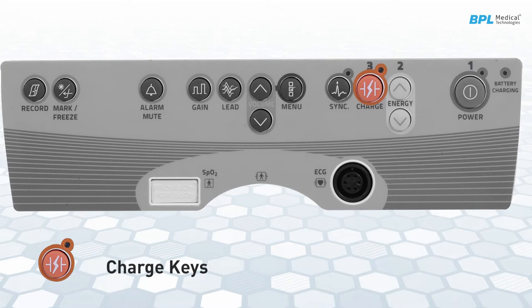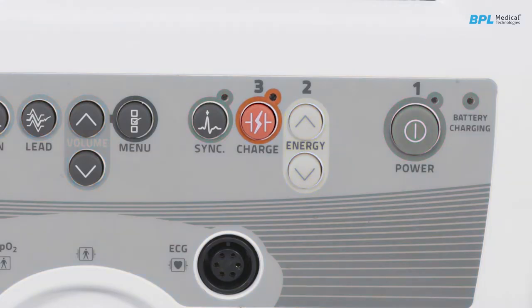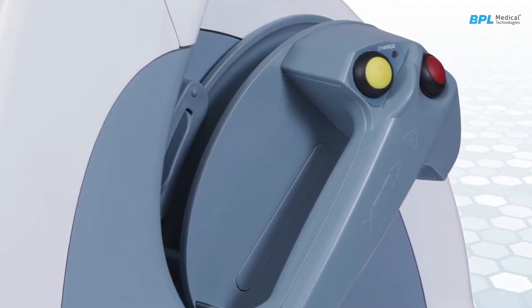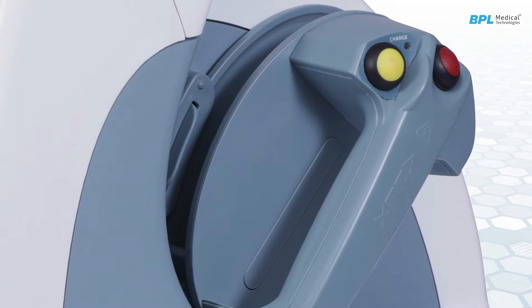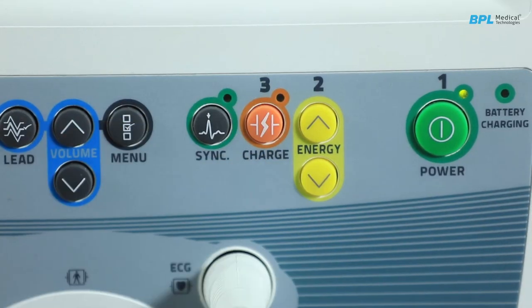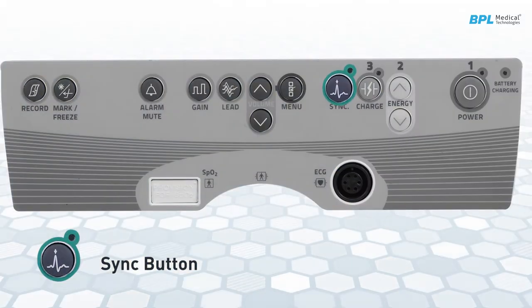Charge keys. Two charge keys are present. One key is located on the front panel and the other key on the apex paddle. Both keys have the same function. Pressing the charge key charges the defibrillator to the selected energy level. When the selected level is reached, the charged ready LED on the front panel as well as on the apex panel is illuminated.